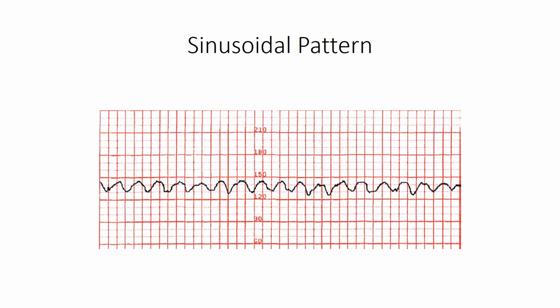Its known causes are chronic fetal anemia associated with erythroblastosis fetalis, usually from Rh sensitization, acute intrapartum asphyxia, fetal maternal hemorrhage, or in utero fetal hemorrhage. At times, I've seen a pseudo-sinusoidal pattern that occurs after a narcotic analgesia was administered to the mom, something like Stadol. But that fetal heart rate pattern went away as the medicine wore off. But true sinusoidal is an ominous sign that something very bad is wrong with the baby.